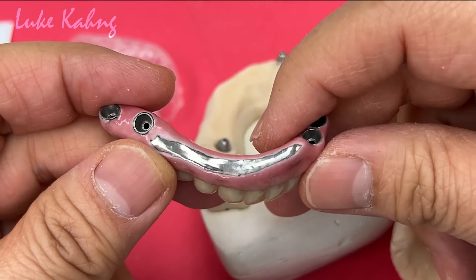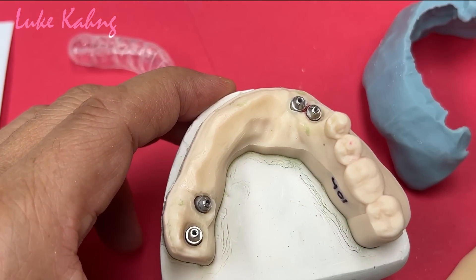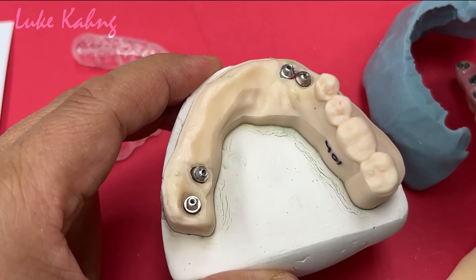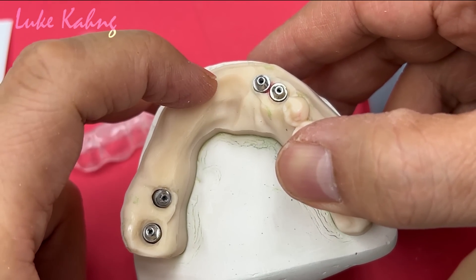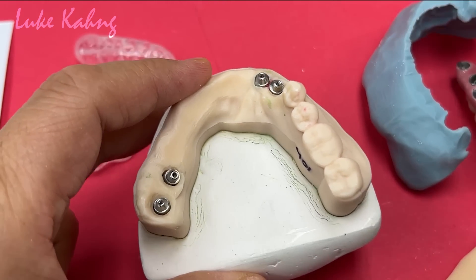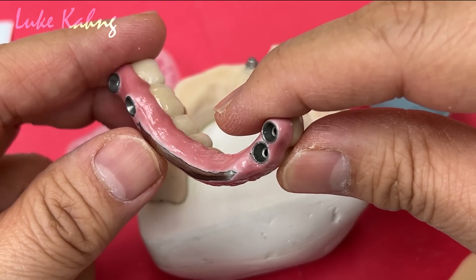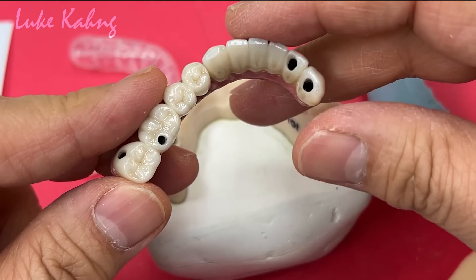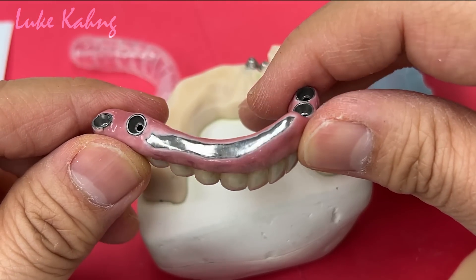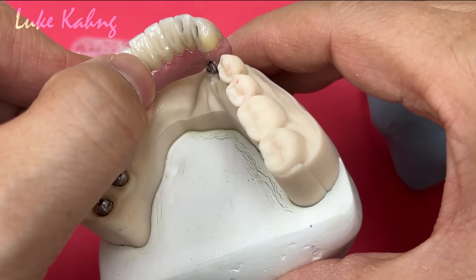A lot of people said the patient needs another implant here and there — yes, that's another option, but the patient has to wait six months and pay more money for one, two, probably three implants. But we don't need it. We developed this over so many years. Made a full hybrid — it's not hybrid, sorry. This is the cast: wax and cast, and then finish the final restorations.